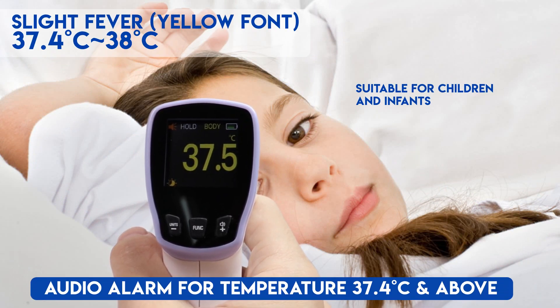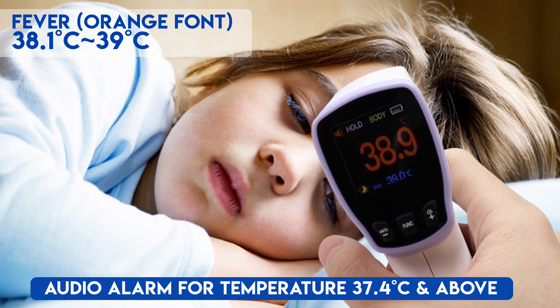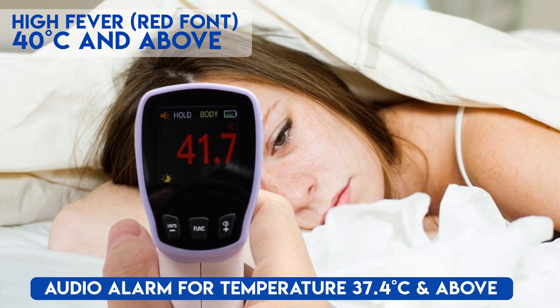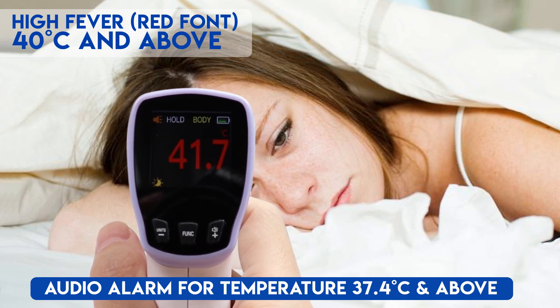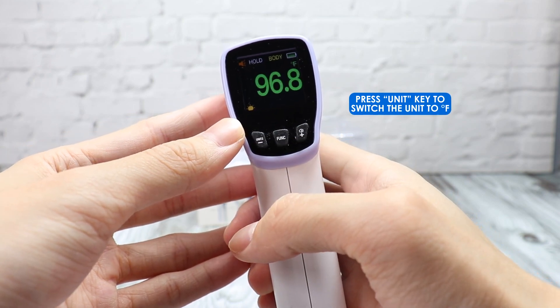For slight fever, the font becomes yellow and an alarm will be heard. Orange font will be seen if the temperature is between 38.1 to 39 degrees Celsius. Red font is for high fever, at 40 degrees Celsius and above. To switch the unit to Fahrenheit or Celsius, press the unit key.